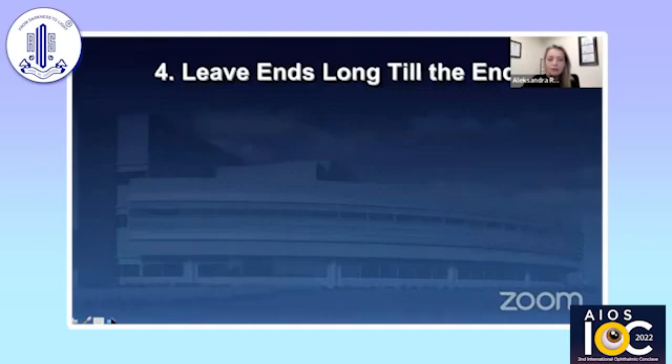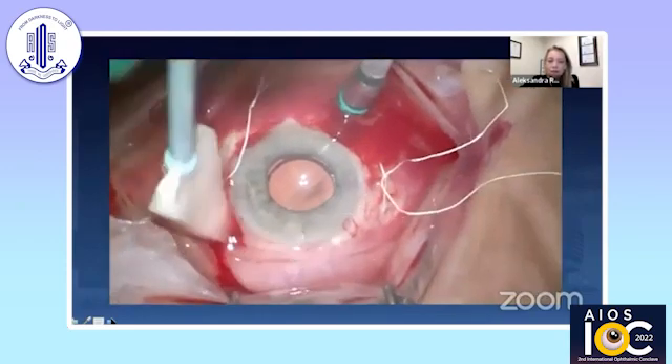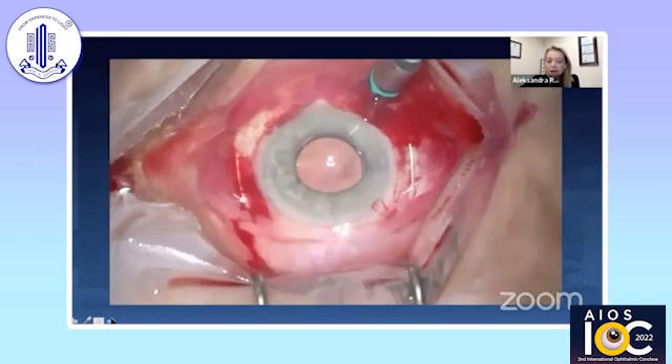Another tip, number four, is to leave suture ends long until the end. This is how we tie it: 3-1-1. Before I cut, I rotate them just a little bit to get them ready in position as I'm going to bury them. I found this useful operating with fellows — it's very hard to judge the tension on the lens when you're watching someone else do it. As we rotated, I realized the suture was quite loose. This was the one time I had to untie the Gore-Tex, and it's much easier to untie and retie if you have longer ends still remaining. So I leave the ends long, move the lens to confirm position looks good, and then cut the suture.